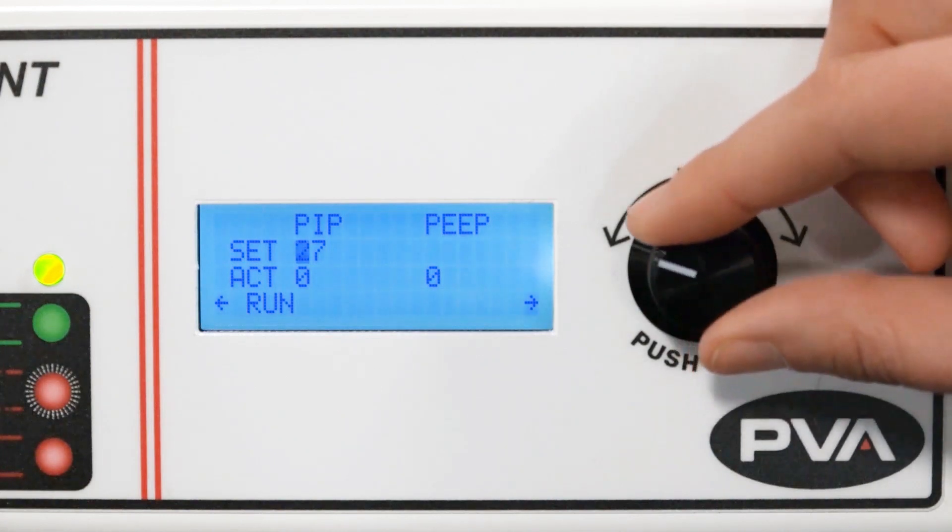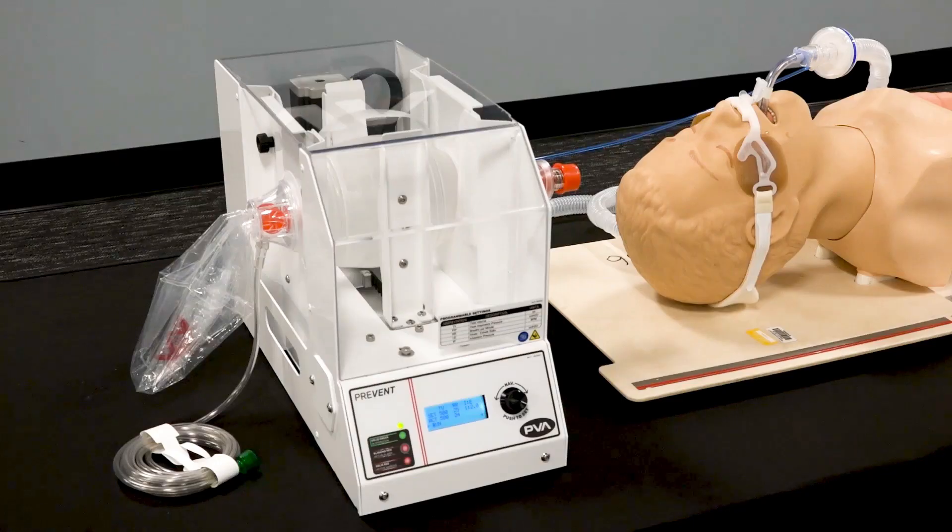To set it, manually adjust the valve to your desired value. Now that the patient is hooked up to Prevent, press run.